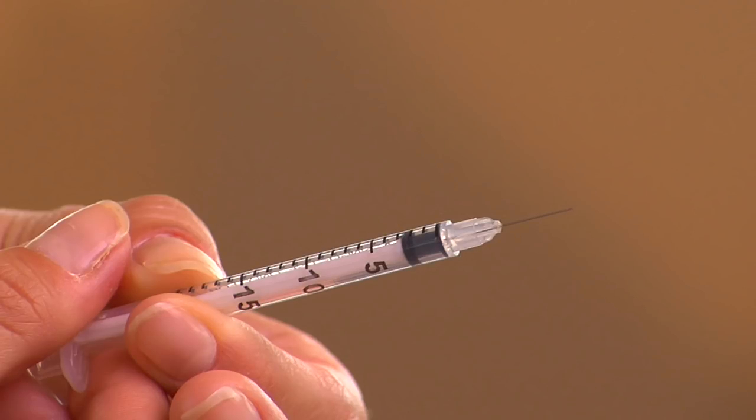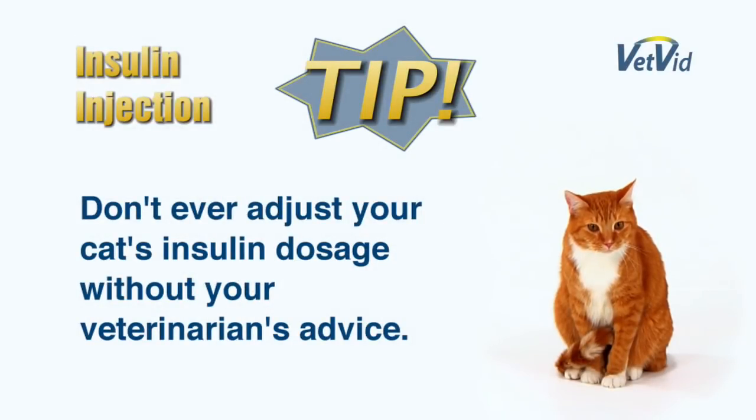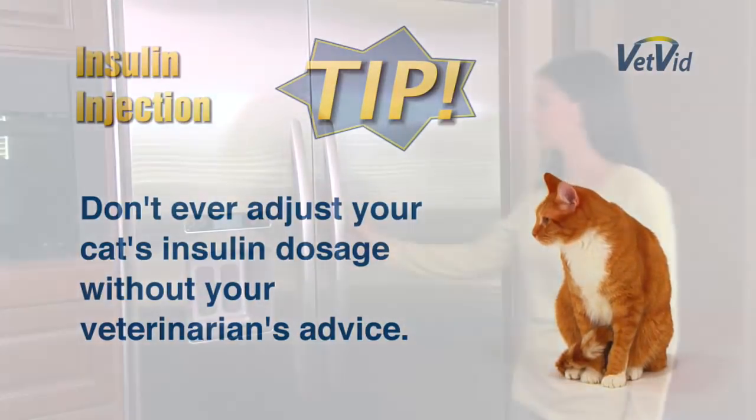You can see how the syringe is marked with numbers indicating units of insulin. Be sure you're giving your cat the number of units prescribed by your veterinarian. And by the way, don't ever try to adjust your cat's insulin dosage on your own — always follow the advice of your veterinarian.